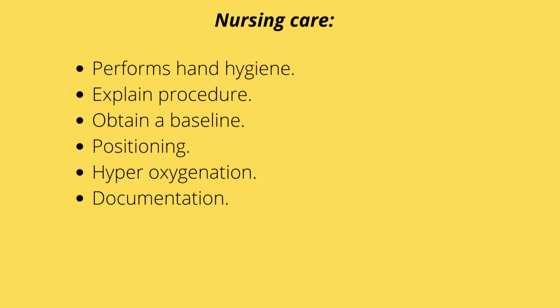Some nursing interventions when suctioning. Always perform hand hygiene. We don appropriate PPE. Explain the procedure to the patient to help them relax, okay? So they're not fighting you. We obtain a baseline of breath sounds, vital signs, and O2 saturation. So you're not suctioning this patient expecting the patient to have an O2 sat above 95 when their norm is 93, okay? We position the patient in a semi or high Fowler's position to prevent aspiration, right?